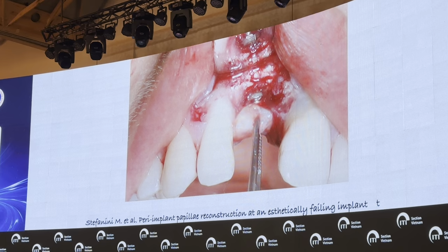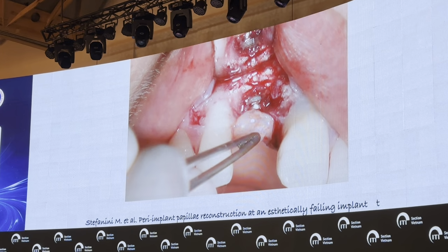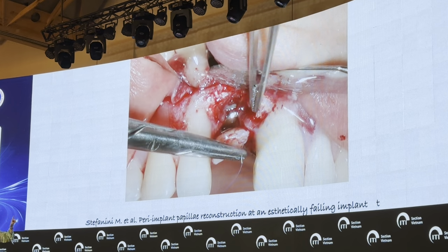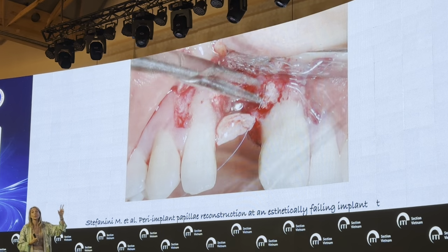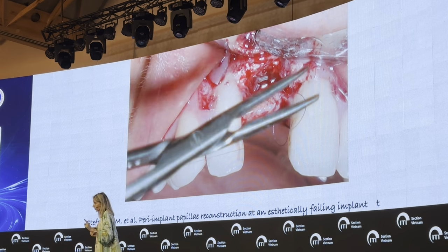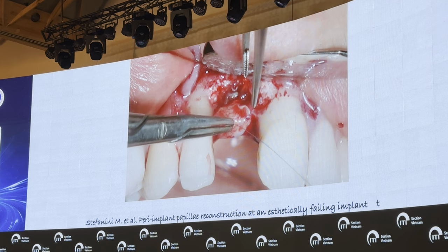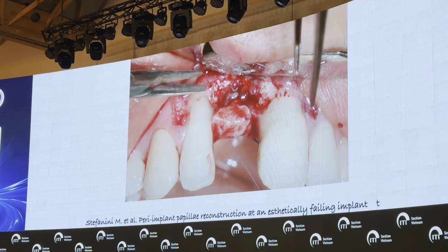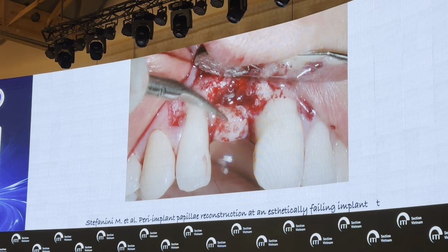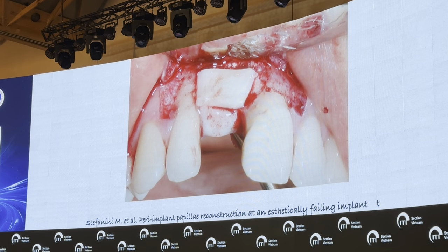As you can see, I was planing the root of the adjacent teeth that presented gingival recession. According to Cairo, these gingival recessions are RT3, so not possible to be covered because of the lack of interproximal tissue. Just remember this because at the end you will see the healing. When I perform the root coverage, I always perform root planing with a Gracey curette, and then I apply EDTA gel to remove the smear layer from the dentin tubuli.